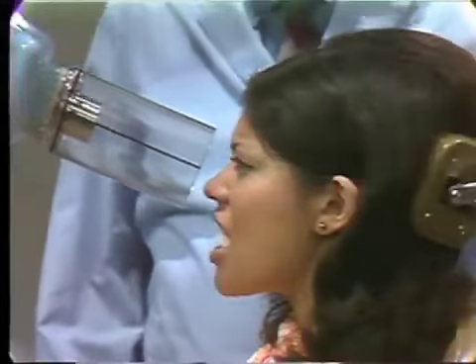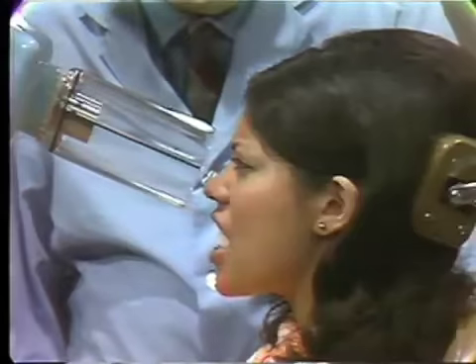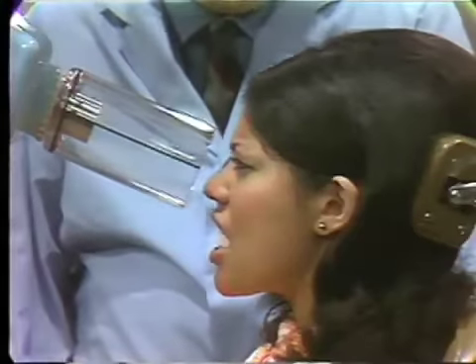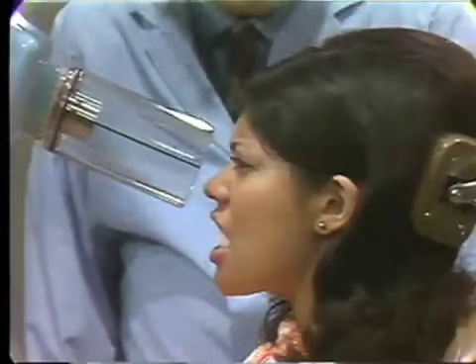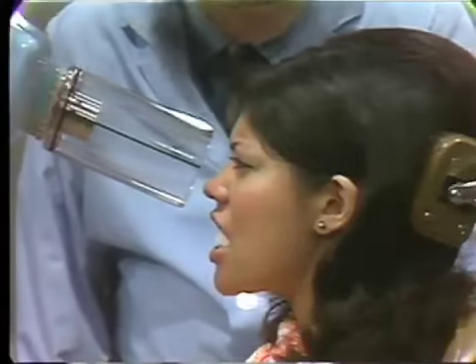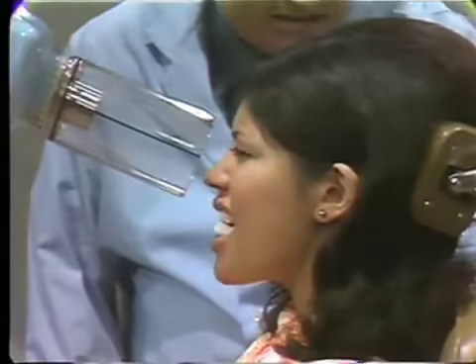Next, we view the patient from the side, and we're to the 4th step, where we want to direct the center of the beam at the center of the film. So to do this, I have to elevate the patient so that the path of the central ray is aimed at her gum line.